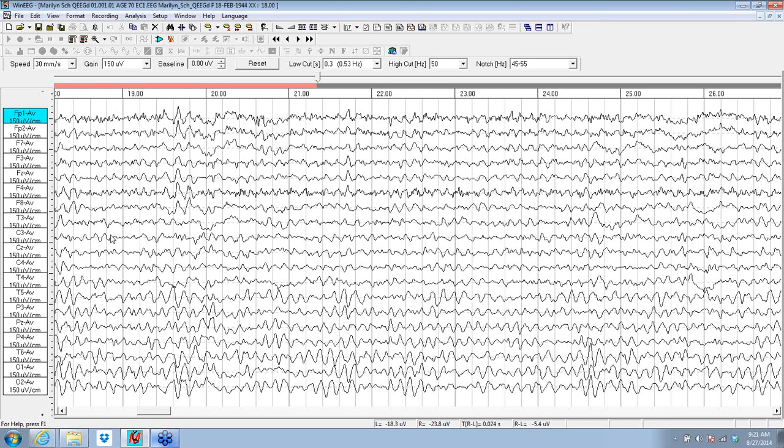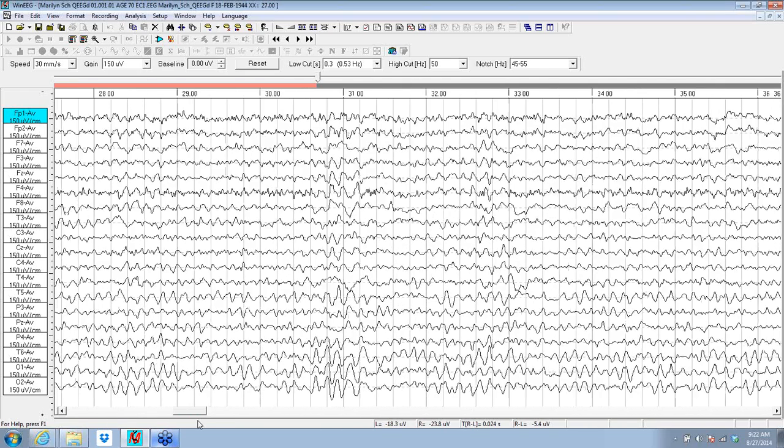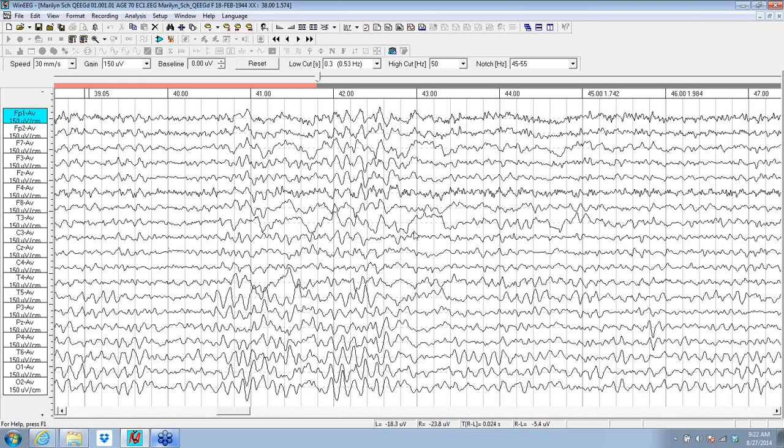So we still see temporal irregular slowing and the temporal slow alpha features, but the alpha up front is extraordinarily stable. And phase stability is coherence. So we expect the coherence to end up being high when we look at the processed files. But again, the temporal intermittent slow content here is clinically abnormal and needs to be dealt with appropriately.